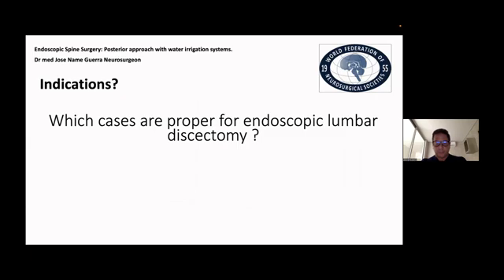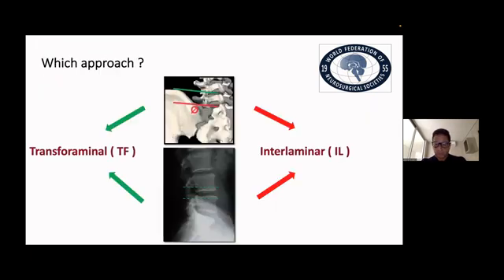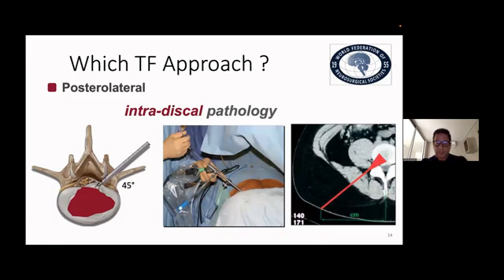Then let me ask you the following question. Which cases are proper for endoscopic lumbar discectomy? The answer is all kinds of lumbar disc herniation could be performed with endoscopic spine surgery. From L1 to S1, interspinal, foraminal, extraforaminal, they would be appropriate to be performed with endoscopic surgery. The approach will be selected depending on the location of the problem and the height of the hip. So you can select between the transforaminal or interlaminar approach.